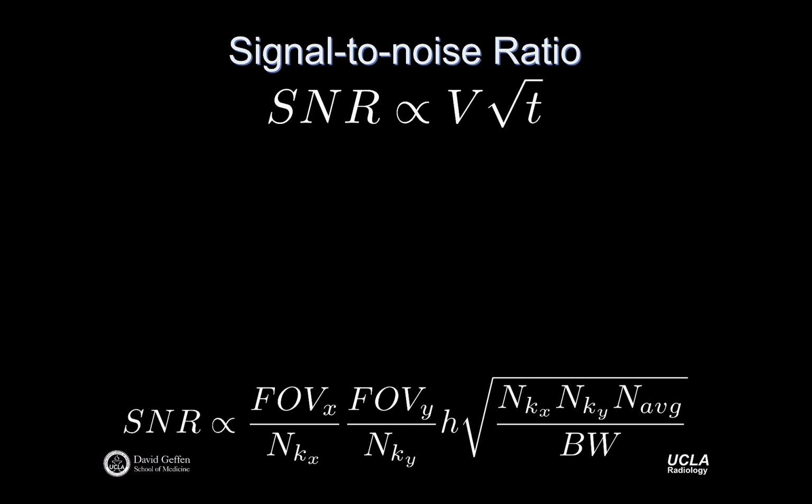And the very end of this lecture is about 10 or 15 slides, where we're going to go through what I call protocol optimization. So you start off having designed some protocol to obtain some images, but the image quality is no good. What can we do to change image quality and finally get to an acceptable protocol? In some ways, this will be very similar to what you need to do in your lab on Wednesday. So it's kind of a class exercise for that. You'll see it in the lab.